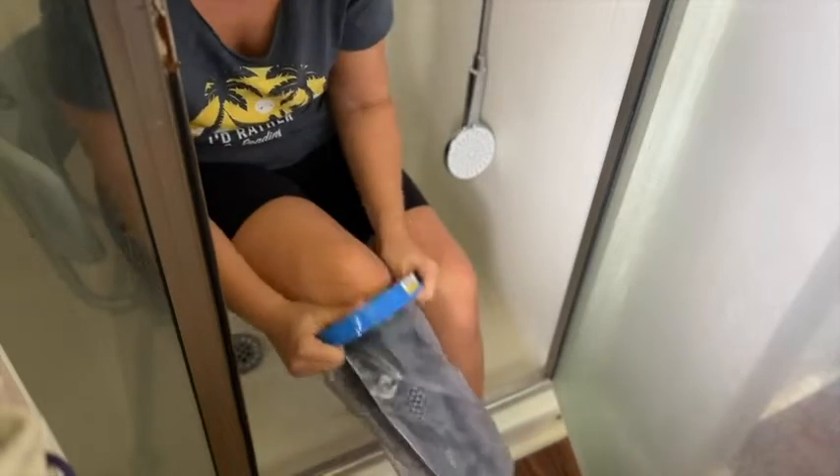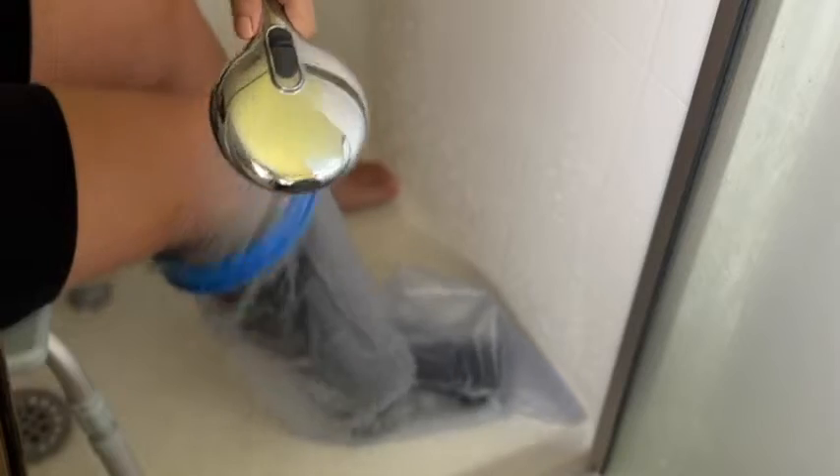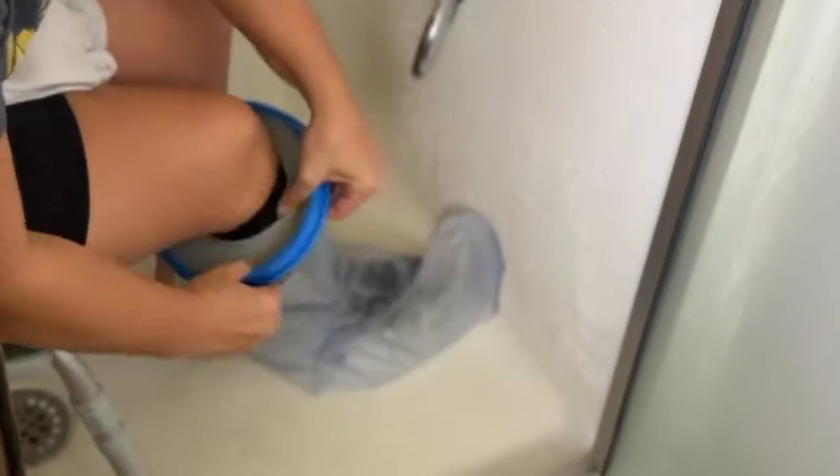There is nothing worse in my opinion than not being able to shower when you've hurt your leg or your foot, and this is such a lifesaver because you're really worried about getting that cast wet, getting that wrapping wet. This is the solution for you. I found it so useful — I was able to protect my leg and still get in the shower. I even went into my pool and was able to put my legs in, which was very comforting after my surgery, knowing my leg was well protected.